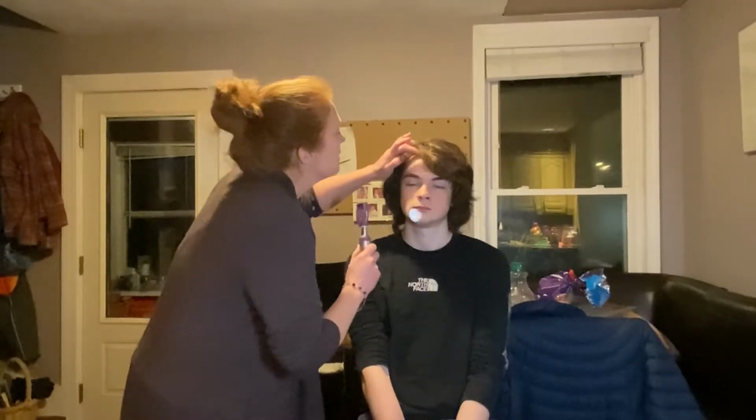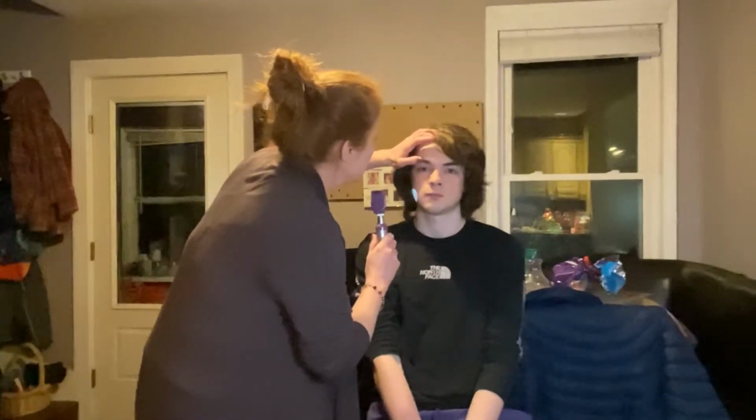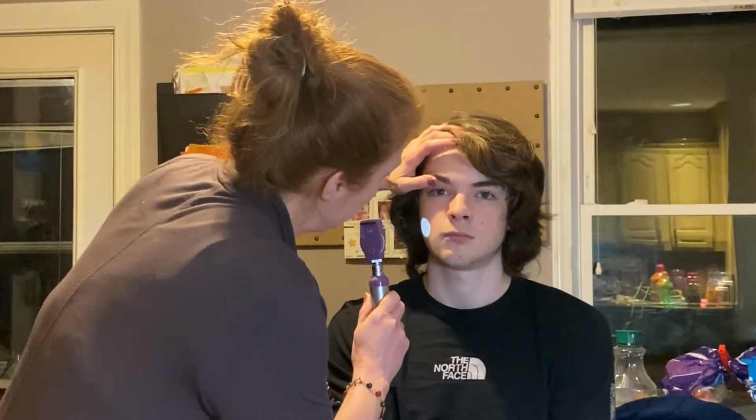Now cover your left eye and read the smallest line you can. I think the second to bottom line says CFDHJ. Perfect. So we have 20/25 out of the right eye. All right. Now I am going to have you look straight ahead. Focus on an object on the wall, and I am going to visualize the interior back part of your eye.